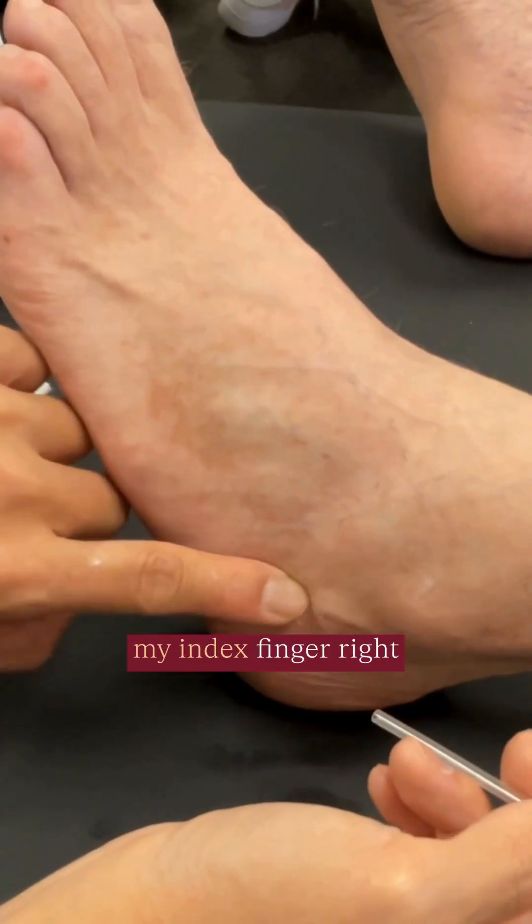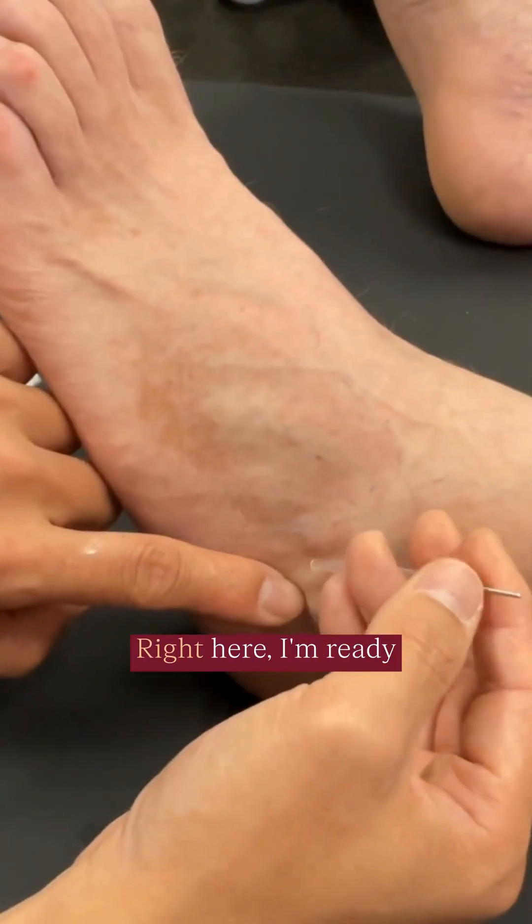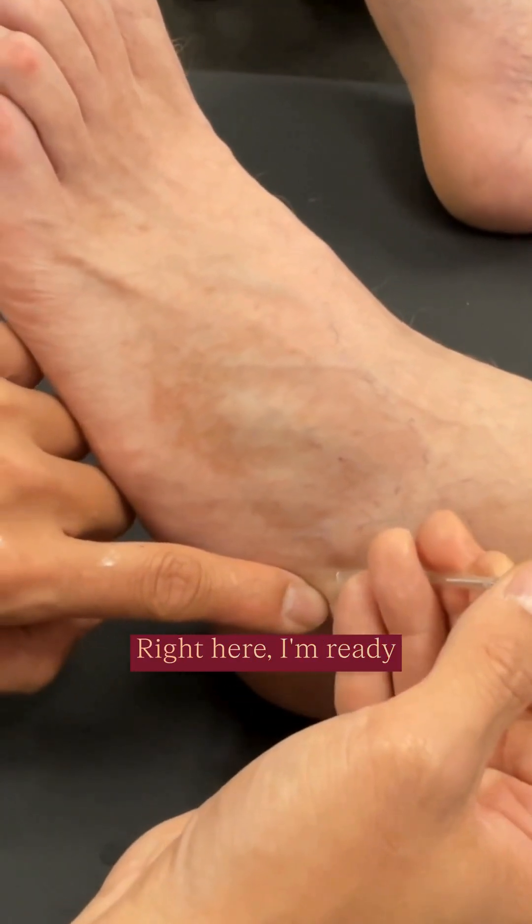I feel the nerve underneath my index finger right now. I go a little bit higher to try to avoid any veins. Right here — I'm ready to start now.